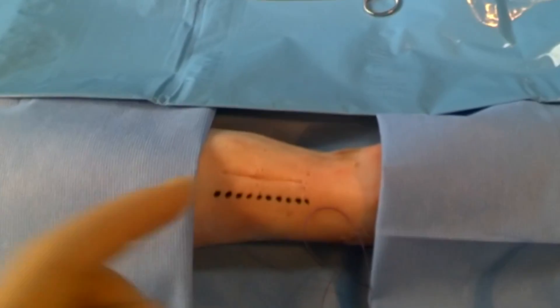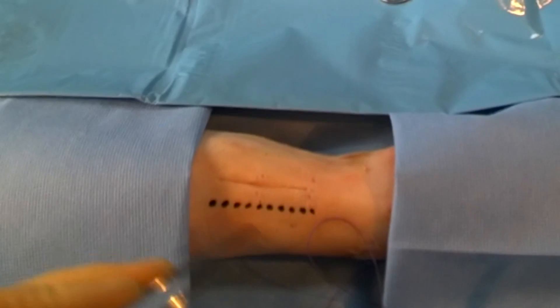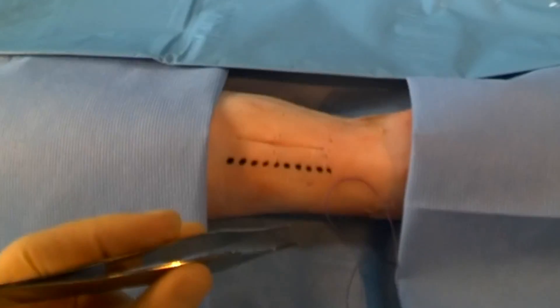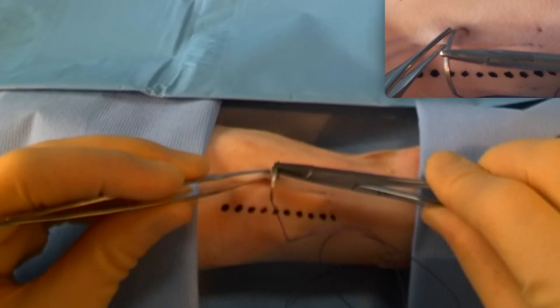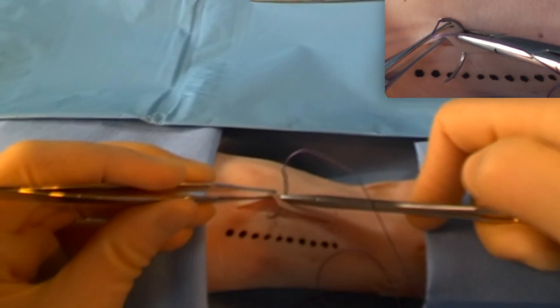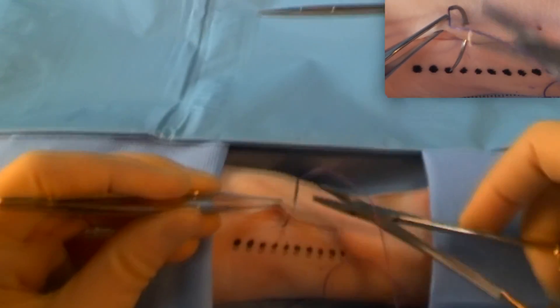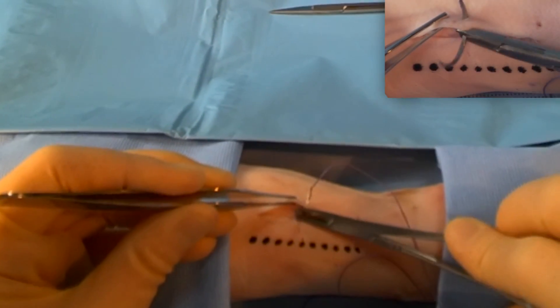Here's our wound with some half-centimetre markers. We're going to aim to do a suture approximately every centimetre. We're going to pop the needle in at 90 degrees to the skin, so perpendicular, coming out into the middle of the wound, using the curve of the needle to go through the wound.